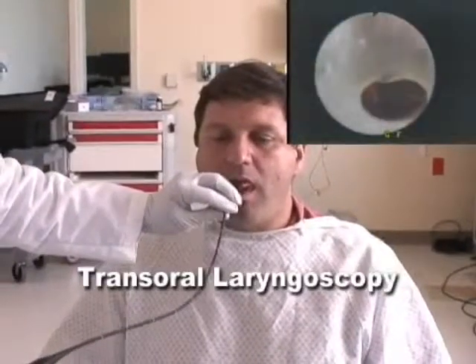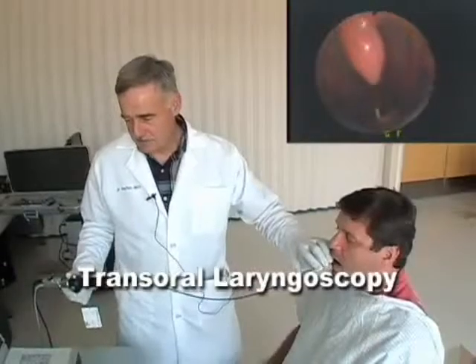Here we go. As you can see, the tube is going down. Here's the uvula. I'm going to go just past the uvula.